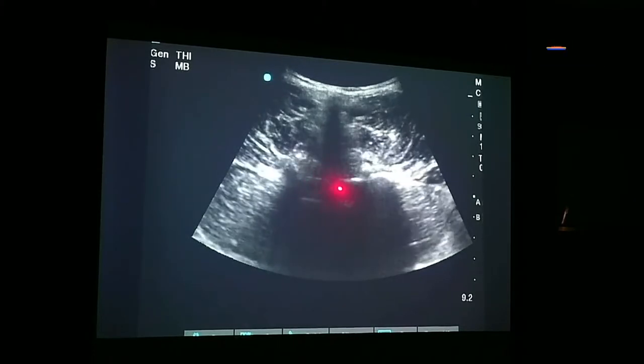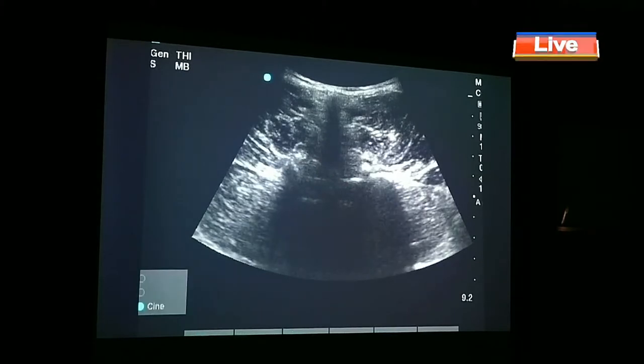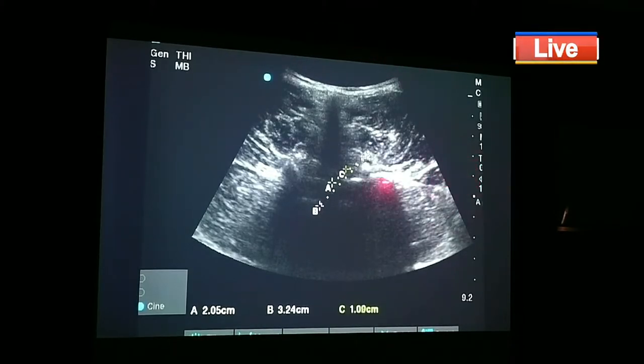Ma'am, can you freeze? Calipers can be helpful. So let us measure now. You measure from here. Set, it comes from Set. Enter. Delete. No, no, I am not unfreezing. I have to make it again. Set here. See, exactly mark. This would be.